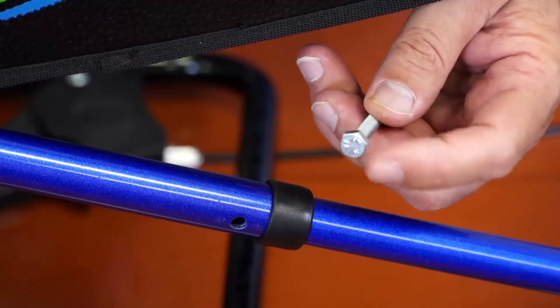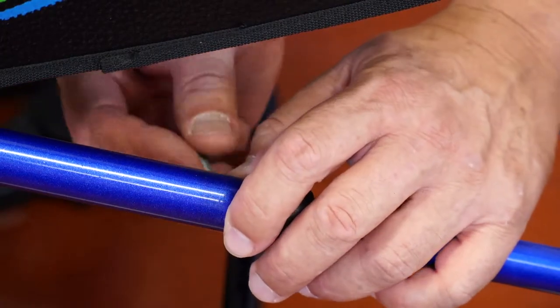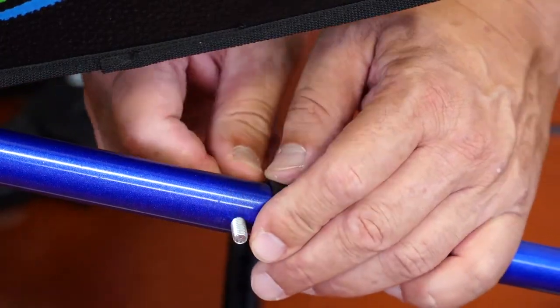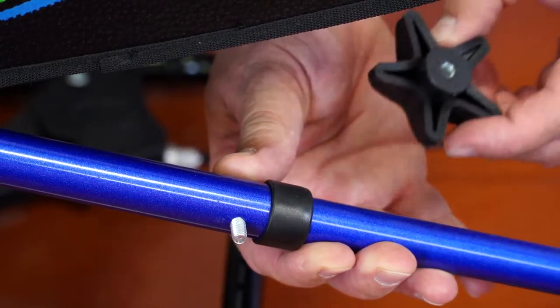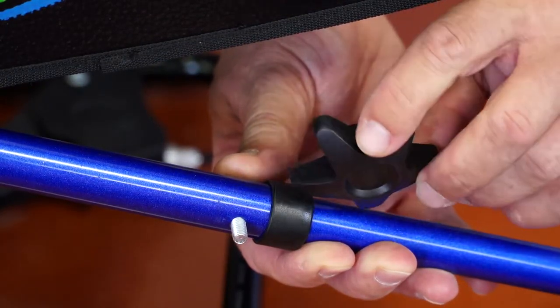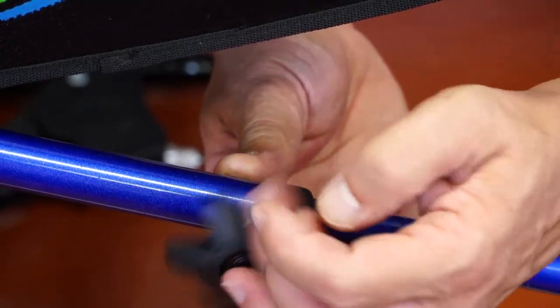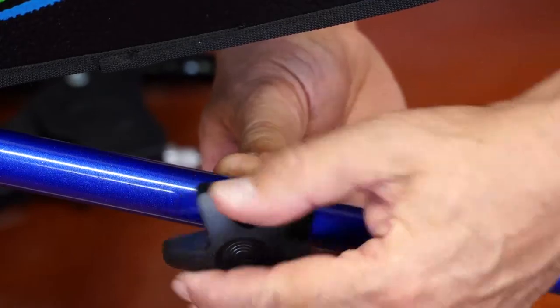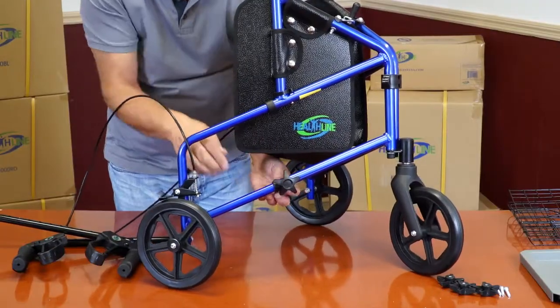Align the pentagon shape of the bolt's head with the pentagon-shaped indentation on the tube. Secure the bolt with the plastic knob on the outside of the frame. Screw it all the way, but do not over-tighten. The wheel is now secured.